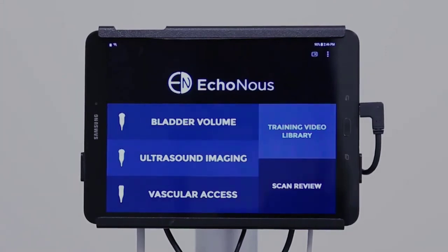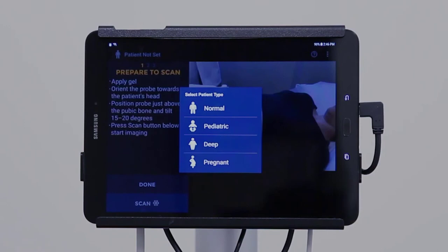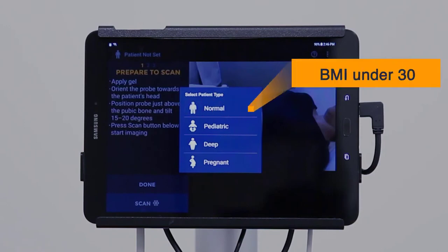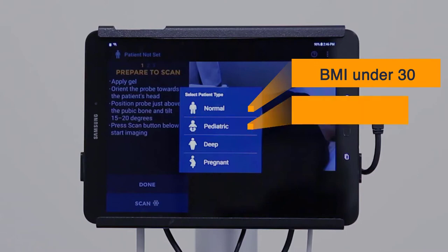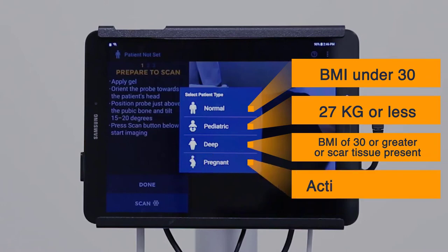To complete a bladder scan, select bladder volume, then select the appropriate patient type. Normal should be used for patients with a BMI under 30. Pediatric for pediatric patients 27 kilograms or less. Deep for patients with a BMI of 30 or greater, or if scar tissue is present. And pregnant for active pregnancy. For this scan, we will select normal.